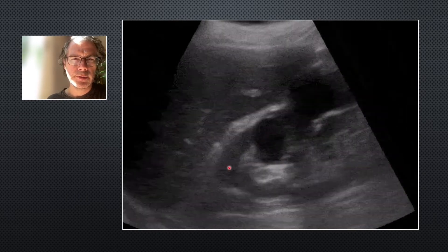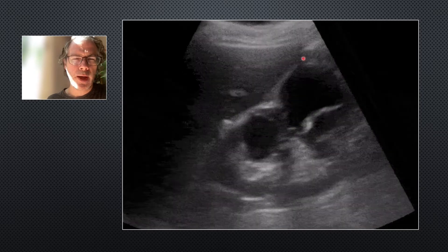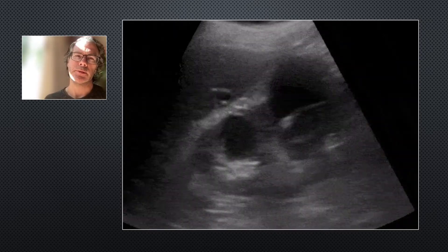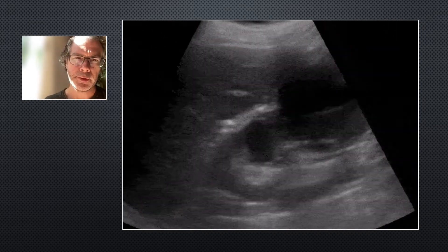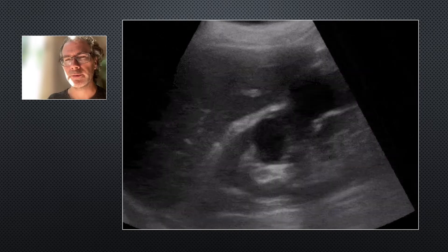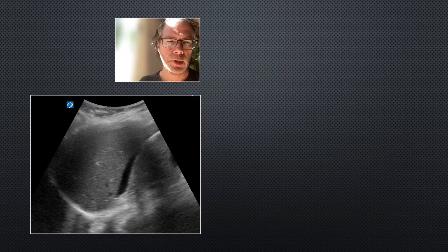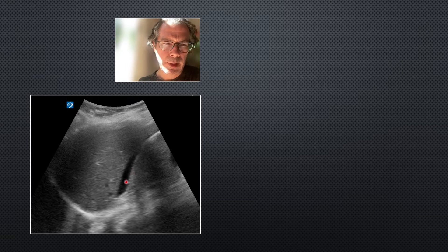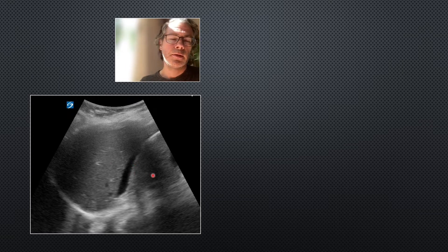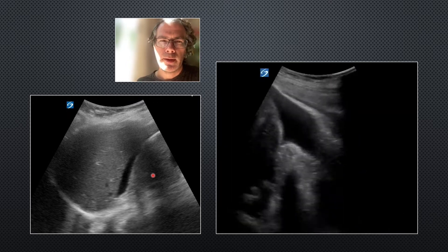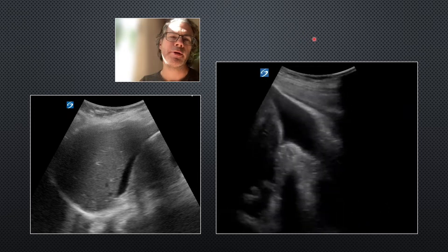Here are examples of the pathology you're looking for in the free fluid scan. In the right upper quadrant with liver and kidney visible, a large anechoic structure might look like free fluid but this is actually a renal cyst — round in shape. Free fluid tends to fill in the nooks and crannies between round structures and looks spiky. Here's a true example: a sliver of anechoic fluid between the liver and kidney. In trauma this could be blood; in liver failure, ascites; in a pregnant female, from a ruptured ectopic. More free fluid shows anechoic areas creating spiky interdigitations between round loops of bowel.